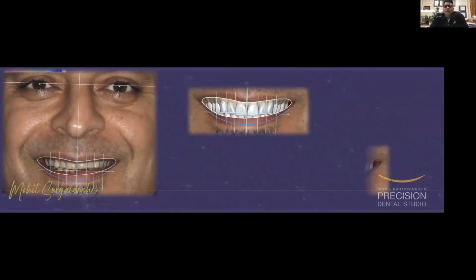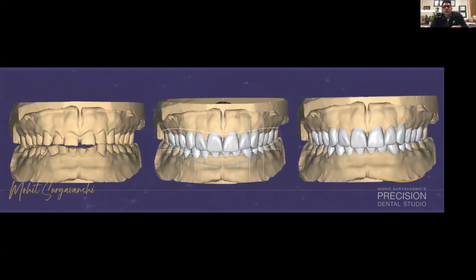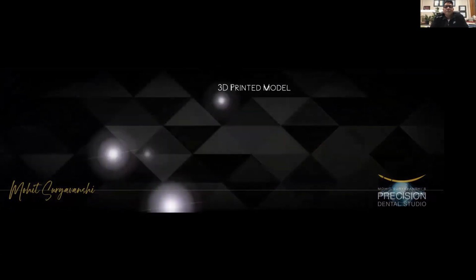And over here, we choose the right midline. We choose the proper smile line of this patient. We have the perfect dimensions and the sizes of the teeth, and it is 3D printed later on. Okay, so what started here, with reference to the patient's smile and personality, we chose the library the right way, and then see the functional. And we printed the models once again.